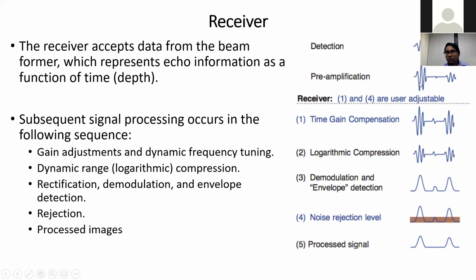And then there are further operations that we perform on this signal. These operations can be tuned by the user or the receiver itself. And these are the operations that we perform.